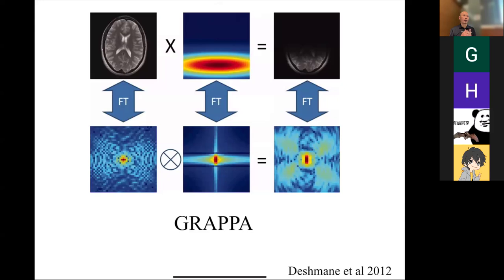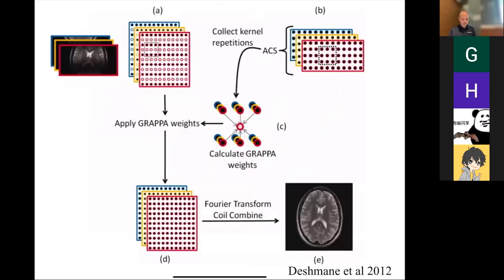On the one hand, that's not what I want. On the other hand, that actually leads to a really cool trick that was invented for that. So the idea is, if I have, let's say, different points in k-space, right?